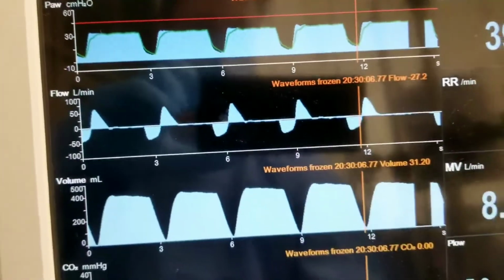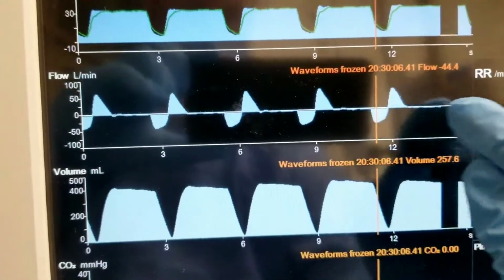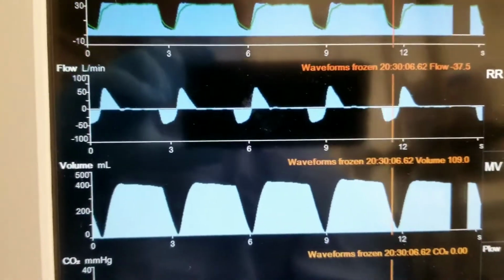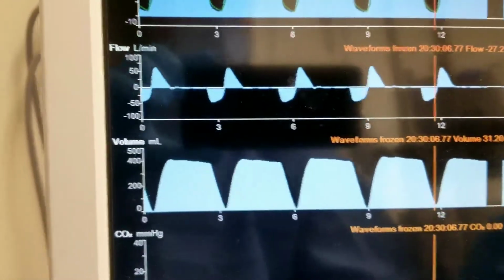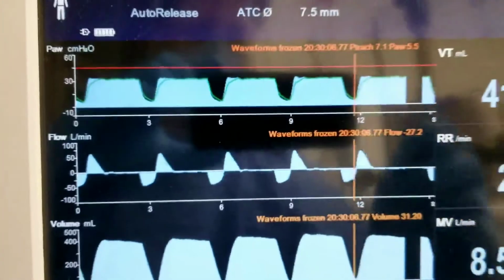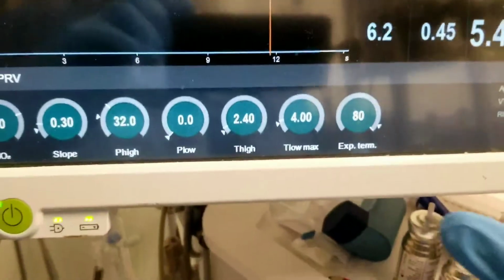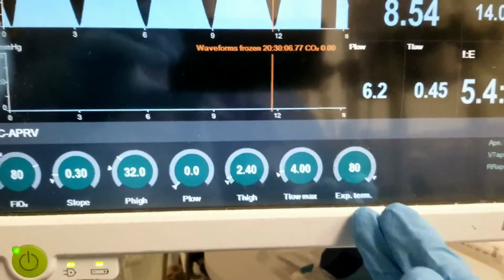Thanks. It was 27, okay? And see, it stops it. See, this thing here would just continue expiring almost like a flow rate, but we stopped it here. Now the vent's doing this calculation usually with the auto release on. If it wasn't on, we would actually have to do the calculation ourselves. So it's a unique option on the Draeger vent.